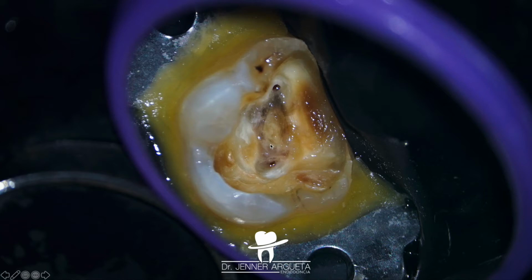As you can see now, it's more evident that we have in this area the floor of the pulp chamber, we have in this whiter spot one calcification that might be covering the entrance of the distobuccal canal, and this yellowish calcification in this area has to be removed.